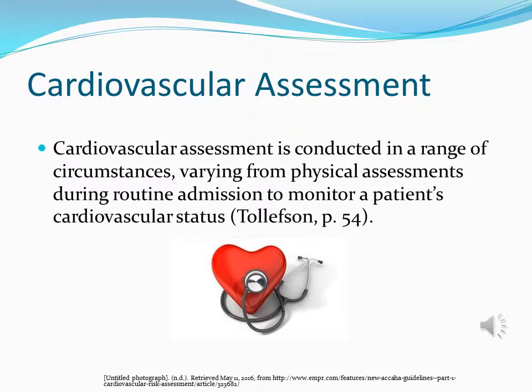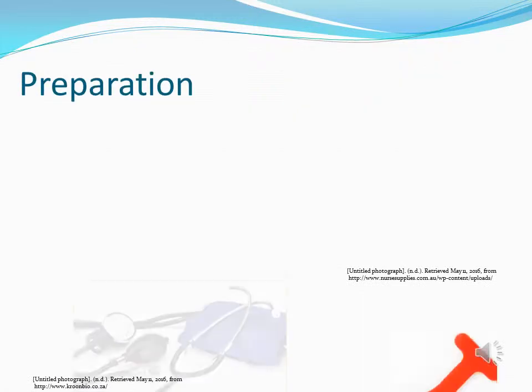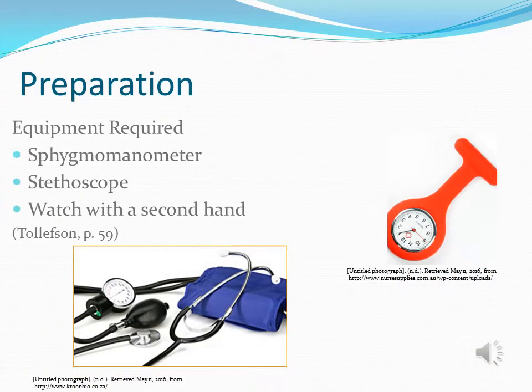Cardiovascular Assessment. Cardiovascular assessment is conducted in a range of circumstances, varying from physical assessments during routine admission to monitor a patient's cardiovascular status. Preparation. Equipment required: sphygmomanometer, stethoscope, and a watch with a second hand.